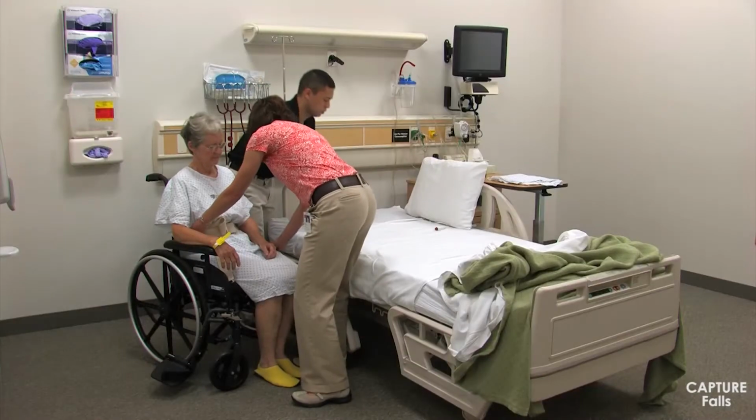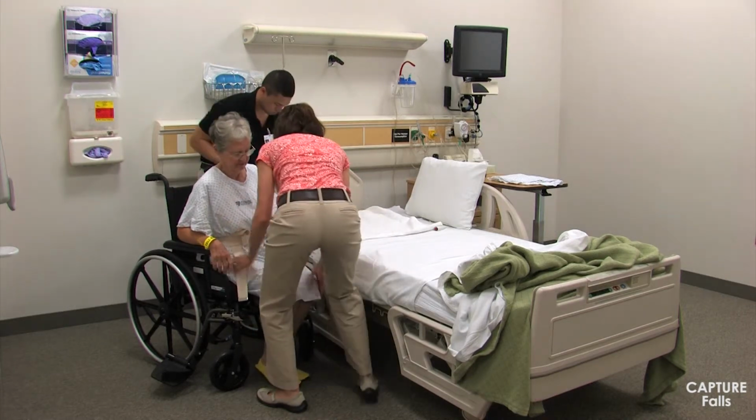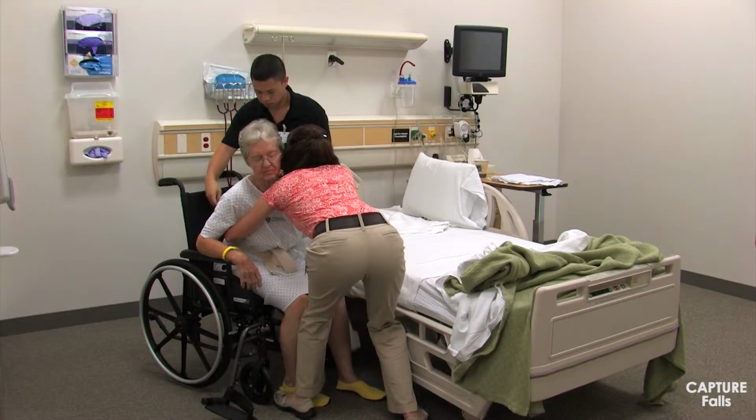The patient's feet should be positioned flat on the floor. You may need to have the patient scoot forward if needed to position her feet firmly on the floor and shoulder width apart. Additionally, scooting forward in the chair will make it easier for the patient to shift their center of mass over their base of support. The caregiver leading the transfer should be positioned directly in front of the patient with both hands on the gait belt using an underhand grip.